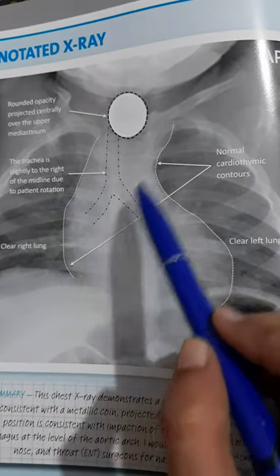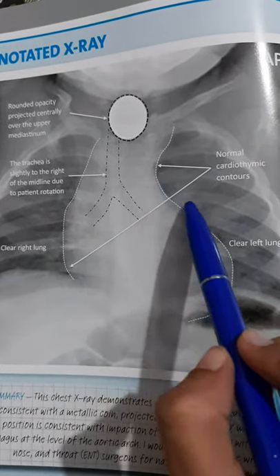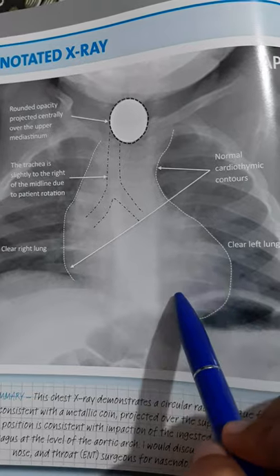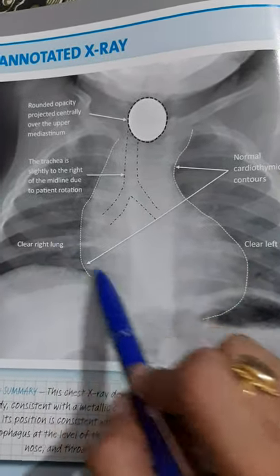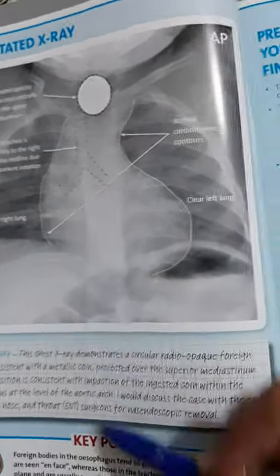Normal cardiothymic contours are seen, and clear left lung and clear right lung are visible.